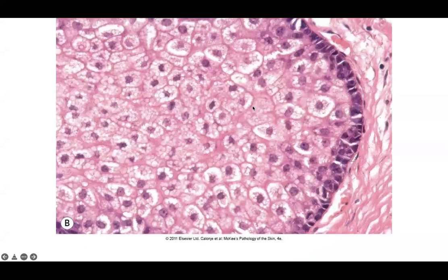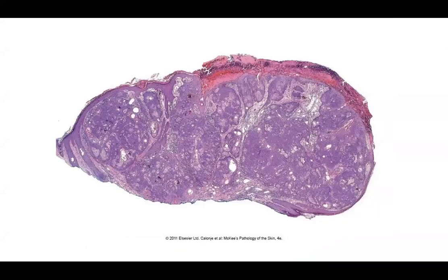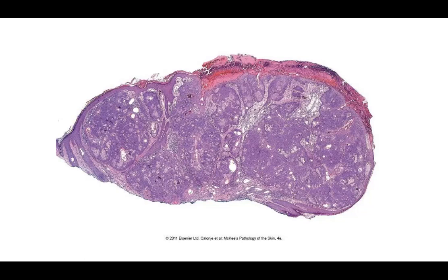You can see numerous well-differentiated sebocytes in most of the lobule. In contrast to sebaceous adenoma, sebacioma has much more blue — greater than 50% of bluer, less differentiated cells — but you still have scattered well-differentiated sebocytes throughout the neoplasm. In real life, if you get a superficial sample with overlying ulceration or erosion, it's going to be difficult to completely exclude a sebaceous carcinoma. You may have to sign it out as an atypical sebaceous neoplasm, favoring whatever you favor, and recommend conservative but complete excision.